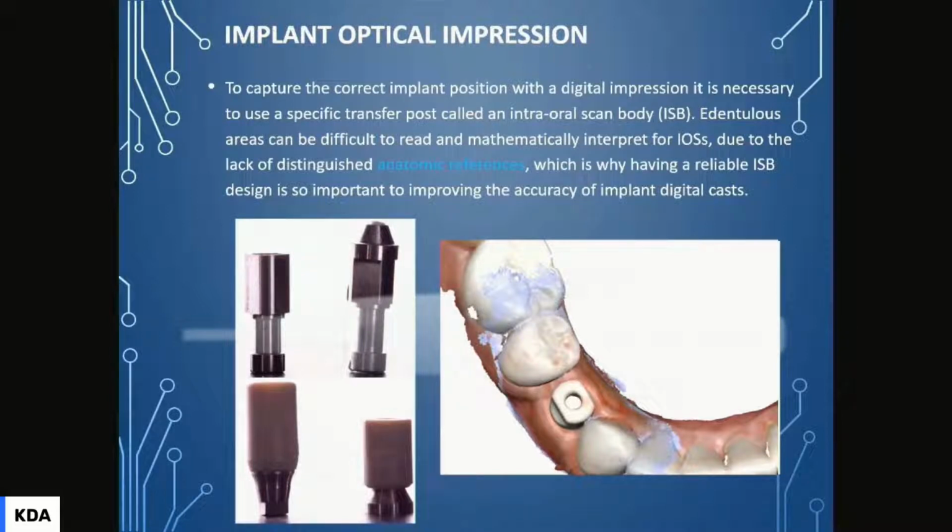But if we have a prosthesis that's going on top of an abutment, like a double crown or a hybrid abutment, we need to use the abutment level scan body. And with the scan body, we have the digital lab analogs, which go into the 3D printed model.